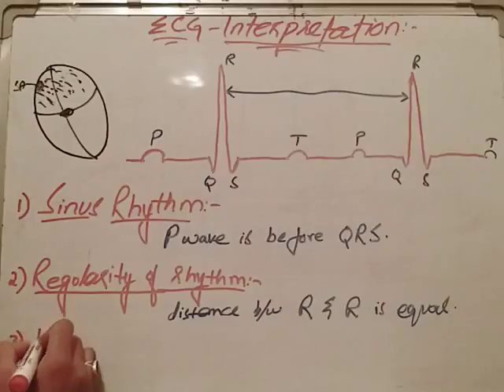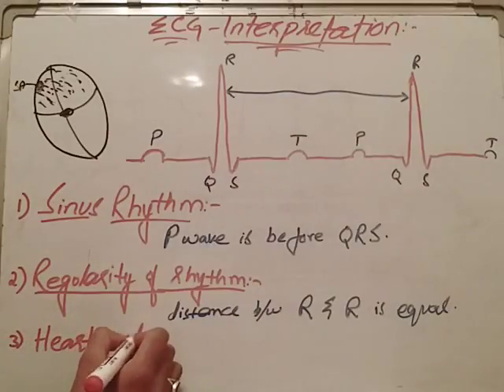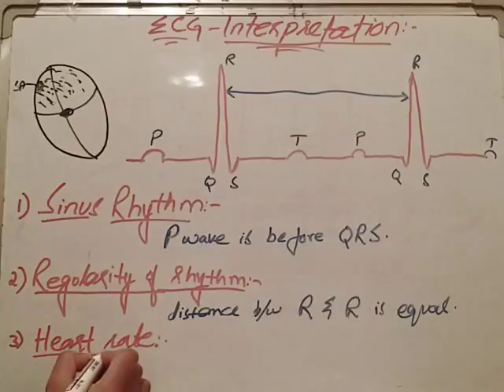And the third thing is that we can measure the heart rate. So we can determine the heart rate from the ECG.